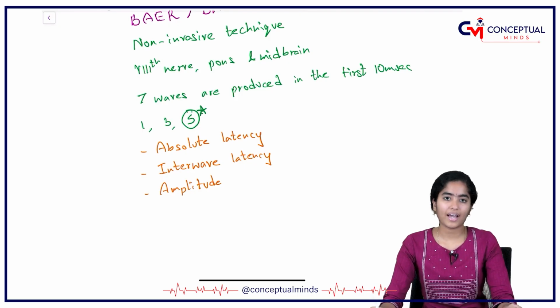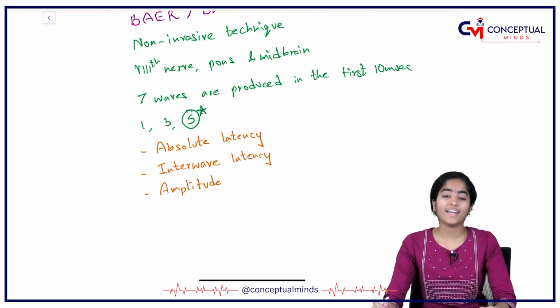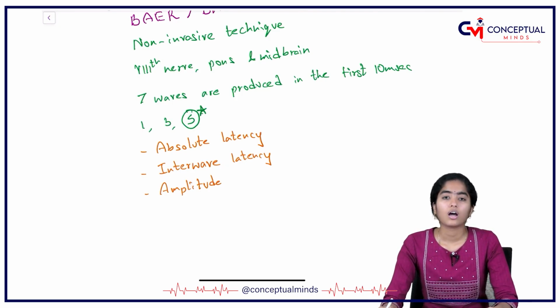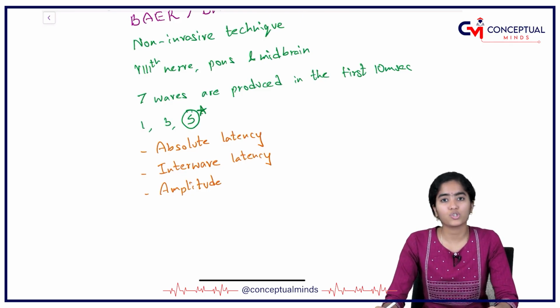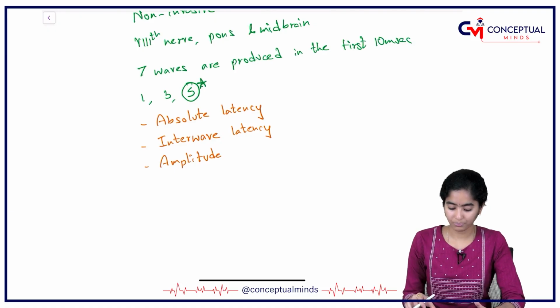These can be identified by BERA, and the advantage is that we get the exact anatomic site of lesion. Although there is no complete information as to which wave corresponds to which site, we do have a broad idea, and let me write that down for you.